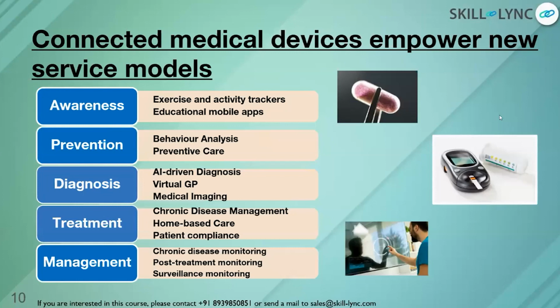As you can see here, one potential application is awareness. As these devices are connected together and always with you, like body-worn or wearable devices, one I mentioned is the smartwatch, or point of care devices. Point of care devices means where the patients are, at that point the device will be present and will be able to do some kind of treatment or diagnosis. Those are called point of care devices, POC for short. A glucometer is one application of point of care devices.